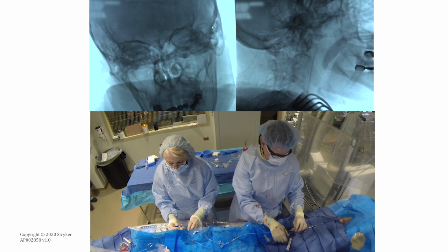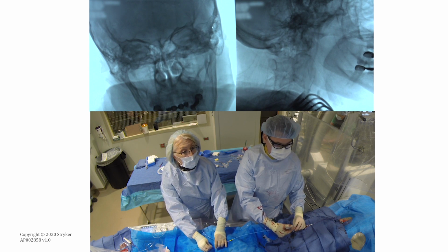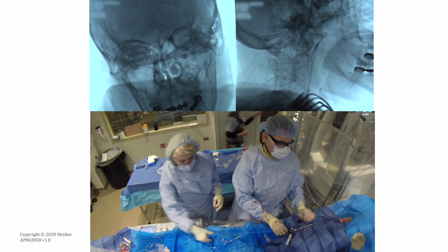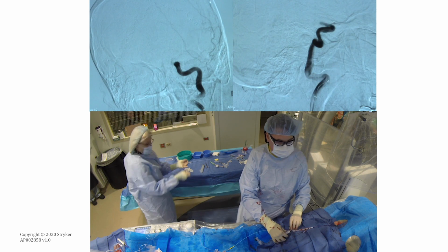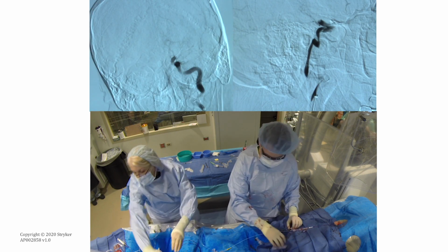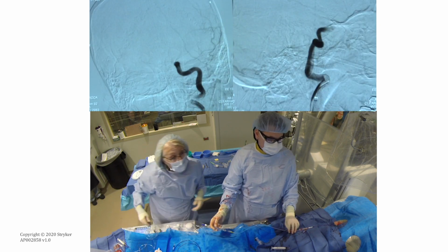Now you can see here we loaded the microcatheter with our Synchro Support wire. This is the Trevo microcatheter, and we now use the 430 Trevo almost uniformly. It seems to have really good trackability in a consistent way, as well as allowing us the flexibility to do more proximal and distal treatments.